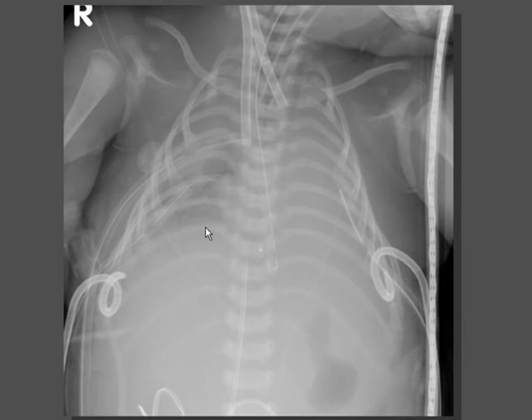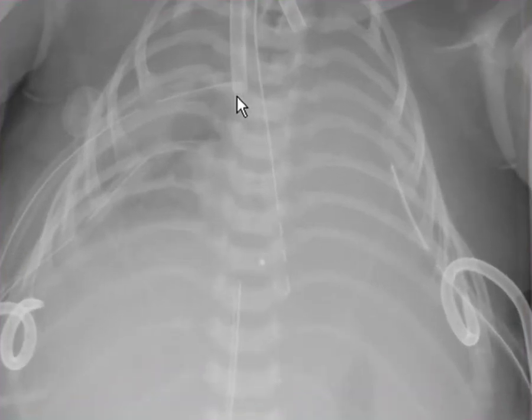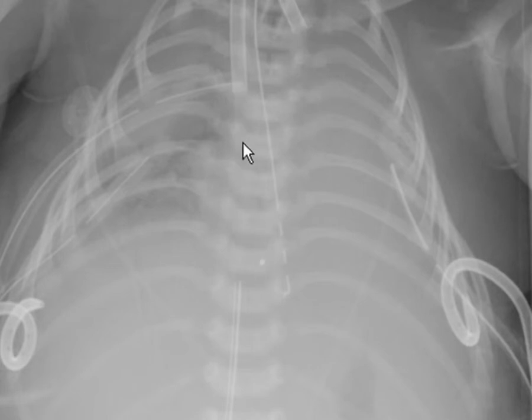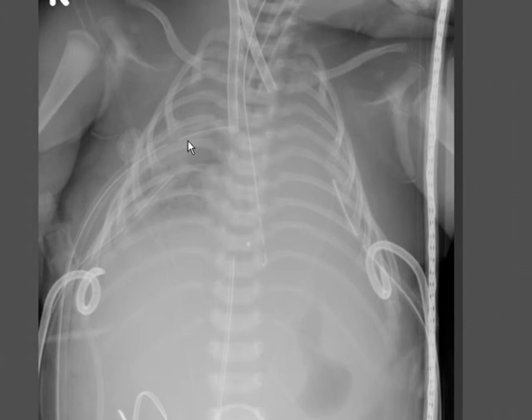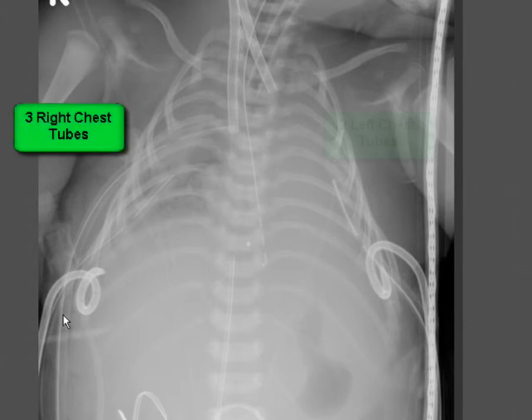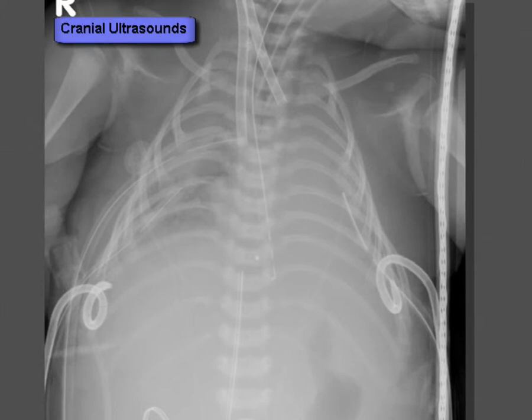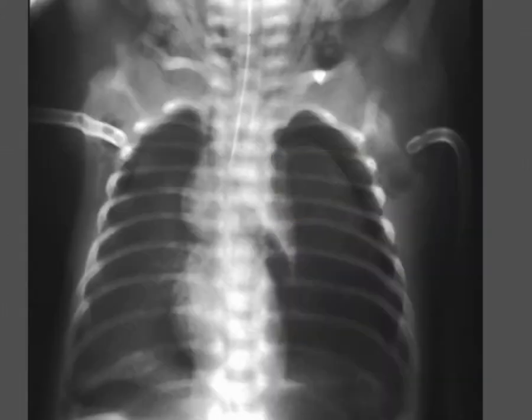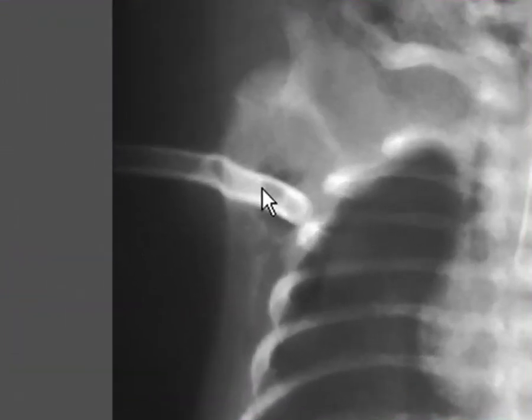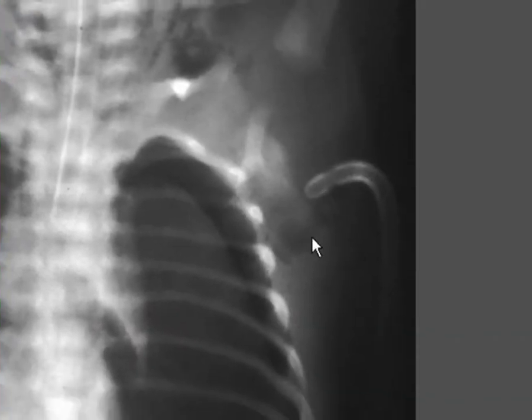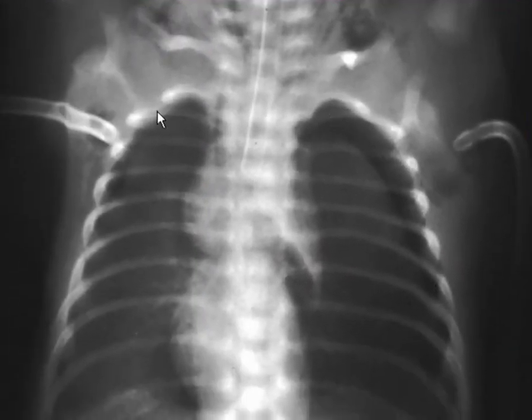It's common to see both lungs whited out on ECMO due to third spacing of fluid and decreased ventilation. Note this dot which is an extension of the ECMO tube — there's a non-radio-opaque portion, and this is where the tube actually ends. This patient had multiple recurrent pneumothoraces and has multiple chest tubes on each side. ECMO patients are anticoagulated so their lines won't thrombose, making them prone to hemorrhage — they get daily head ultrasounds to check for ventricular bleeding. Chest tubes can terminate in subcutaneous tissue; you can see air around the tubes and persistent pneumothoraces.